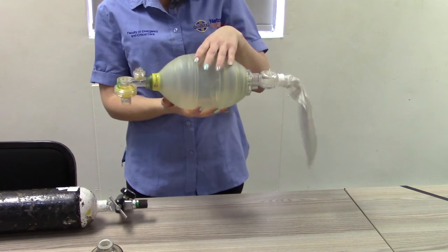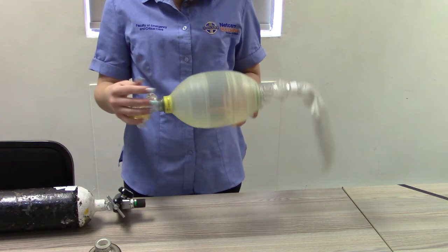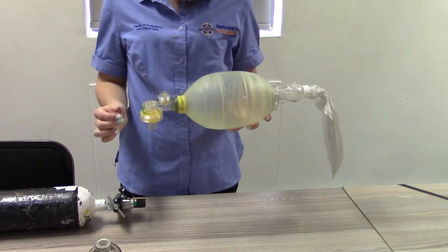Occlude the patient connection port with your hand and compress the ventilation bag to generate pressure, ensuring there are no leaks of the BVM, with the pop-off valve locked.